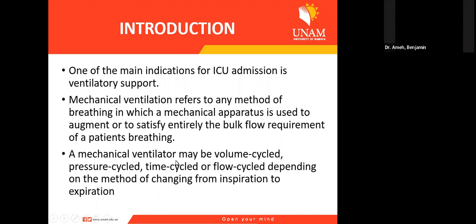So generally speaking, mechanical ventilation is any method of breathing in which a mechanical device is used to either augment or to supply the entire bulk flow requirement of a patient's breathing. So a mechanical ventilator can either augment the patient's breathing or take over the patient's breathing completely.